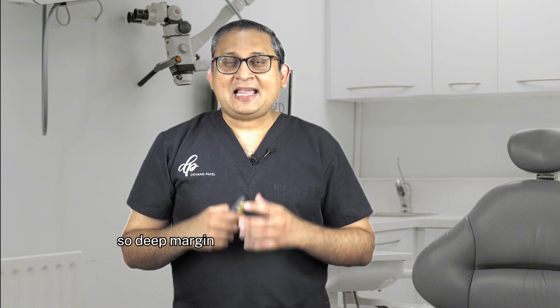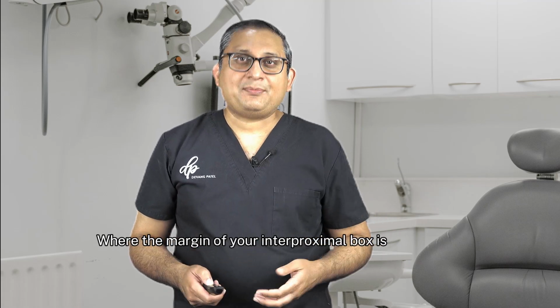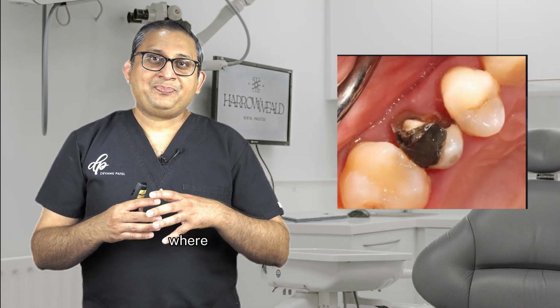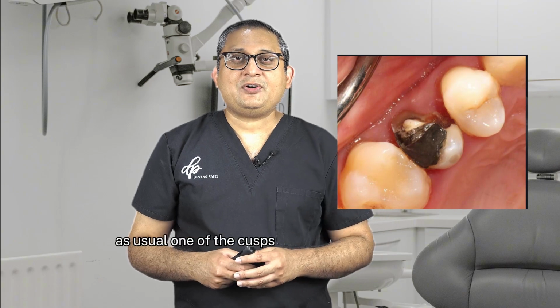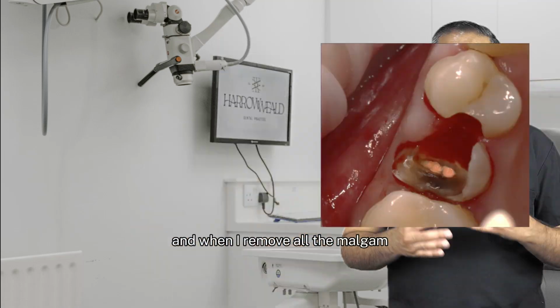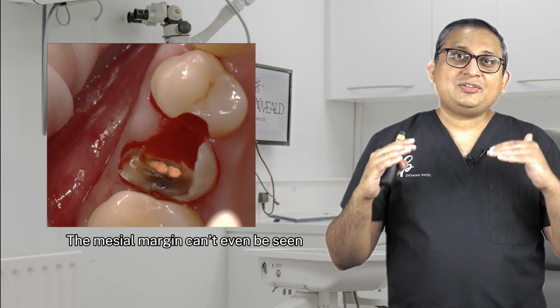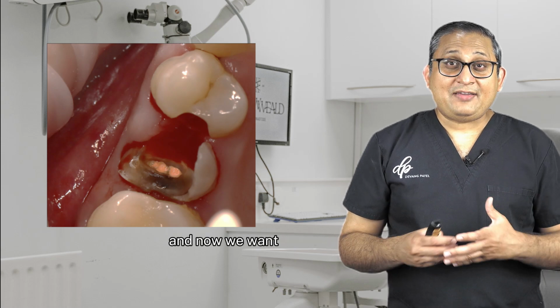So deep margin elevation is simply a deep class 2 or MOD or deep restoration where the margin of your interproximal box is subgingival. So look at this case where the patient had a huge amalgam. As usual, one of the cusps of the tooth was fractured, and when I removed all the amalgam, you can see how subgingival the margin is. The mesial margin you can't even see because it was so subgingival, the bleeding was everywhere. And now we want to save this tooth.